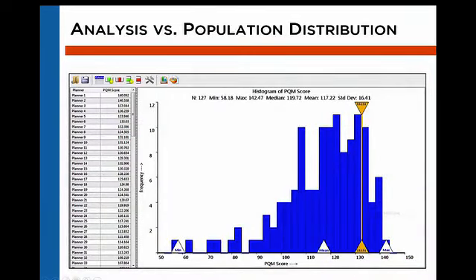Then, of course, when you generate scores, either for an individual metric or for the composite, you can then see how did my score line up with the population of my peers? Where do I stand in this distribution? Not only in the distribution of all planners, but maybe you can filter it by people who use VMAT, people who use IMRT, proton users, certain planning systems. We then will present those data and educate people on the sources of variation, and then also on the best practices we derive.